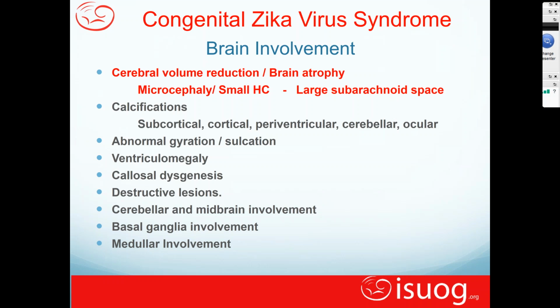We don't typically measure volume of the head. I think it's more the MR individuals who like to suggest maybe the brain looks a little small. We hardly report that in ultrasound. I suspect if there's a lot of subarachnoid space compressing the brain, we might be suspicious of it. Or if there's lissencephaly, we might be suspicious of it. But typically we don't. So, but we've got to think about that, particularly in the congenital Zika virus syndrome, as we talk about.